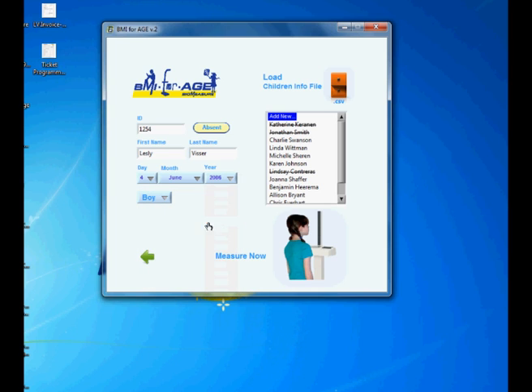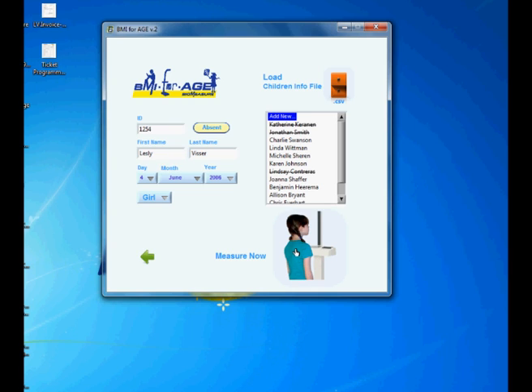Day of birth and then gender. And then you have entered manually a new child and you are ready to measure.